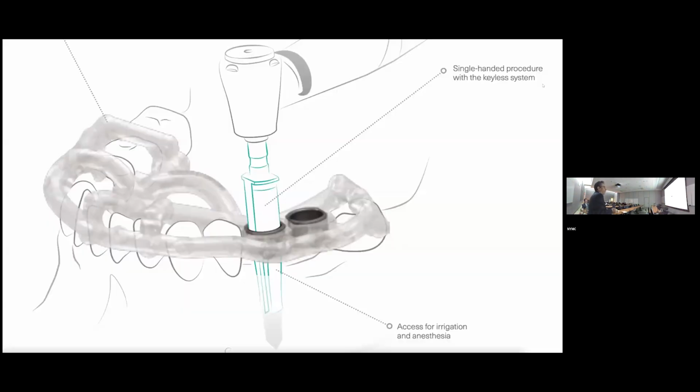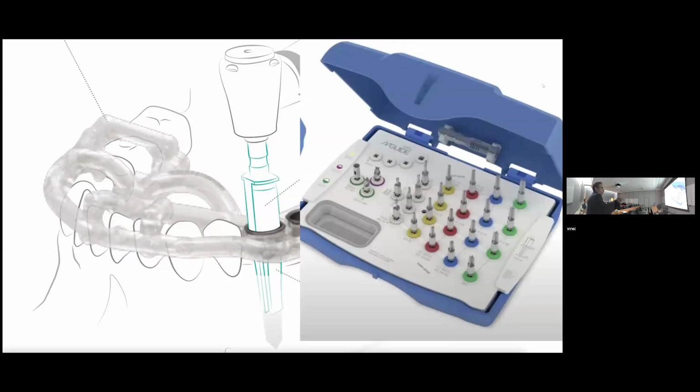I know that this is where we're gonna end up. And I have my drills that will go right into that pilot hole and drill right into the bone. And these are the drills.